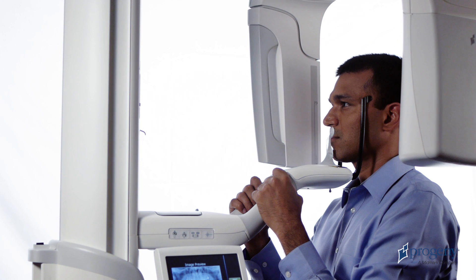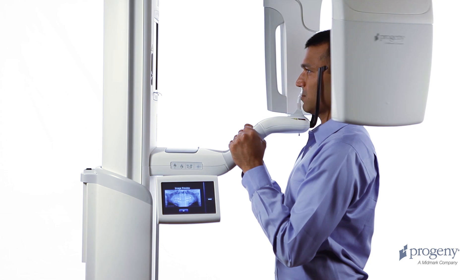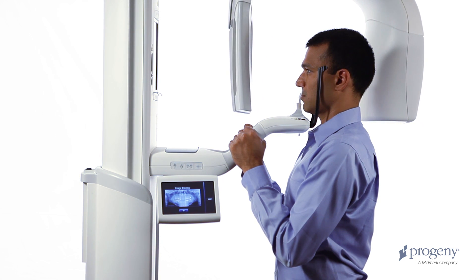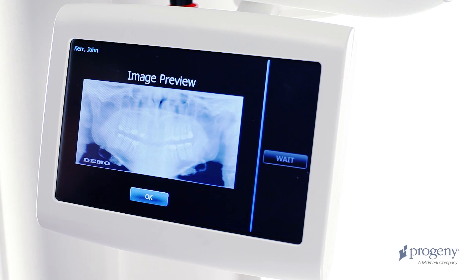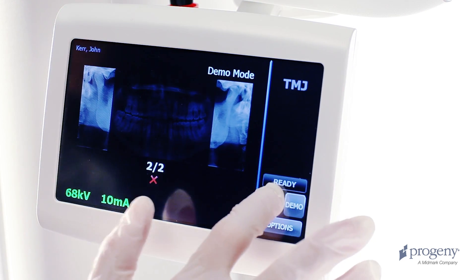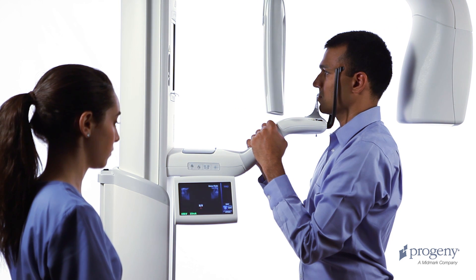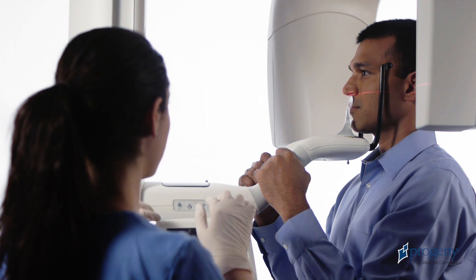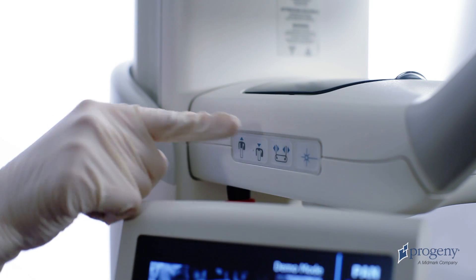As the overhead structure drives to the patient exit position, allow the patient to relax, but advise them not to step out of the structure even when the head positioning wands open. Verify the first TMJ scan on the Vantage Touch display and press OK. While the patient remains in place, return the overhead structure to the patient entry position. Once this movement is complete, realign the patient's Frankfurt plane, mid-sagittal line, and close the temple support wands.